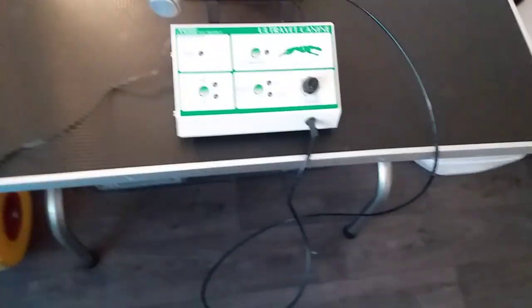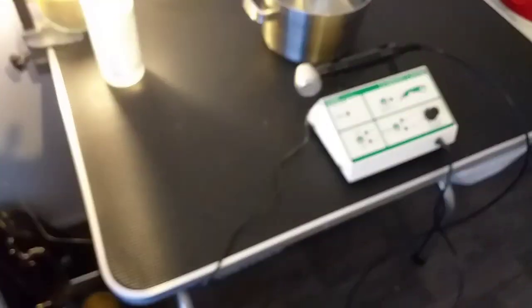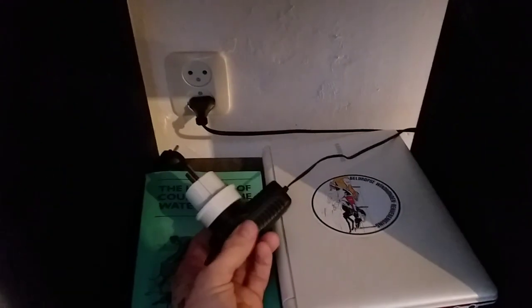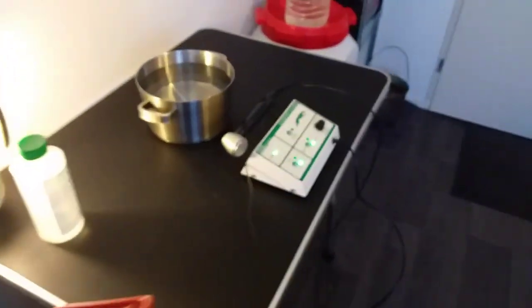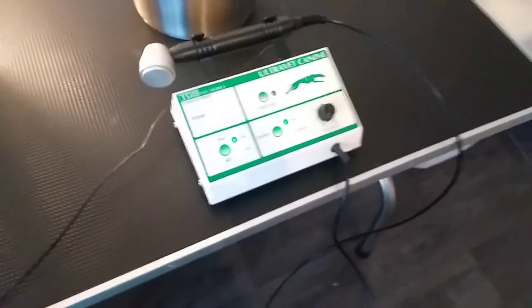I've prepared everything. I put the machine on the treatment table, a little bit to the front so the dog doesn't stand on it. I've wired the cable away so he doesn't get caught on it. He will also be strapped to that belt. As you can see I've put the adapter on. This machine, if you plug it in, it's immediately on. There's no on/off switch for that, so you have to keep it unplugged. If I would say there's a downside, then it's that.